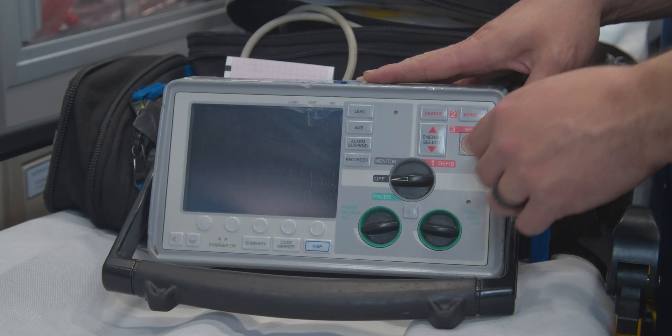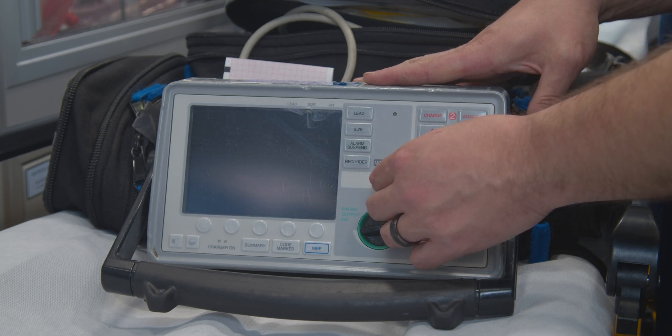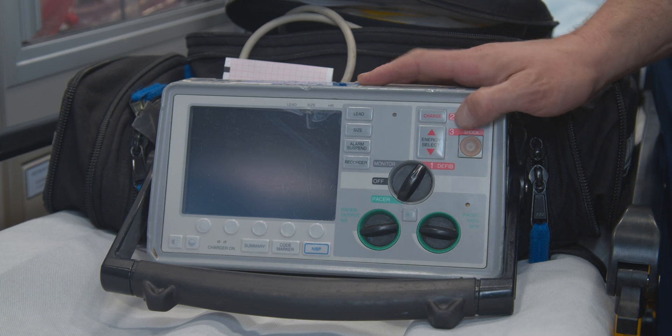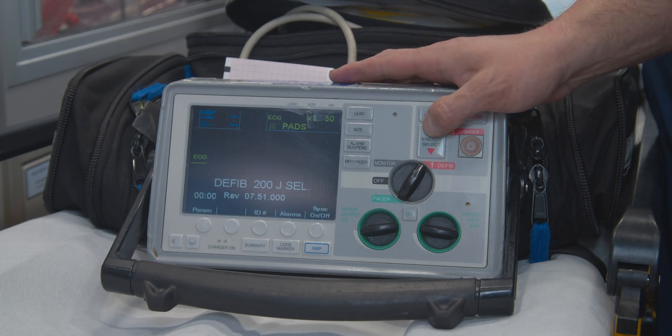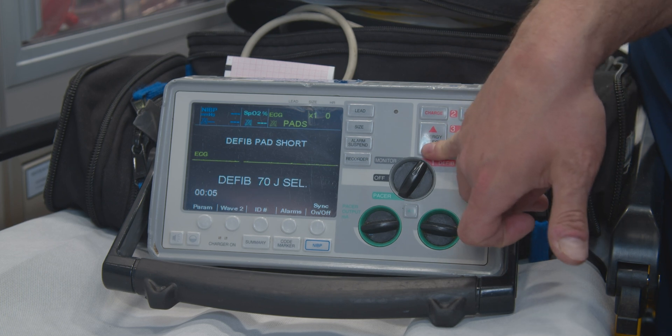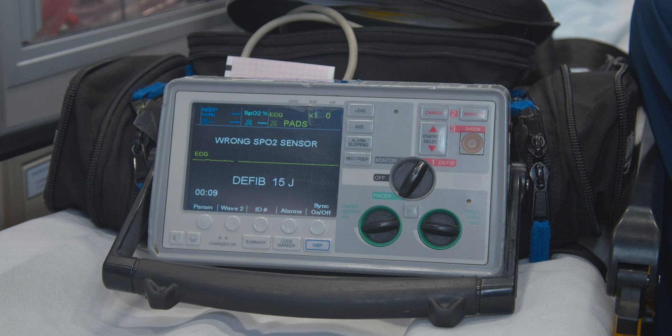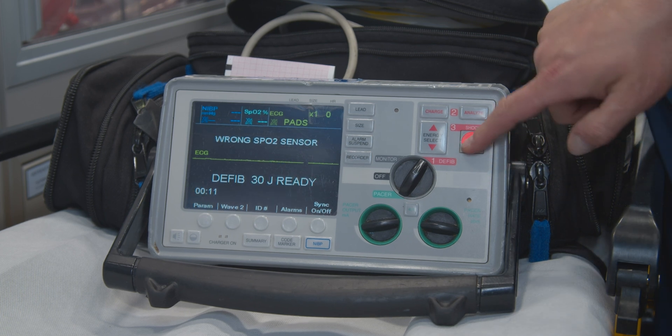Going through some of the functions and doing the defib test at the beginning of your shift — click the defib. It starts off at defib 200 joules. I'm going to drop it down to the 30 joules that we do our tests at. Charge. Shot.